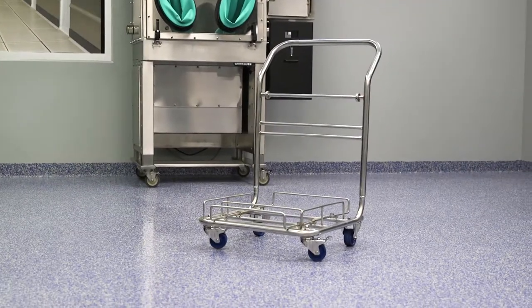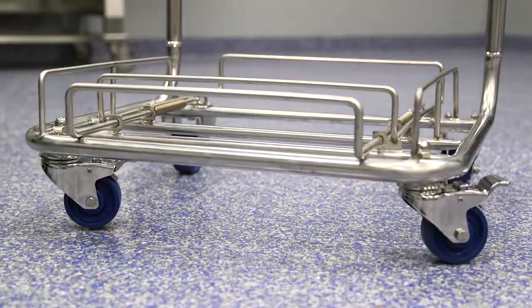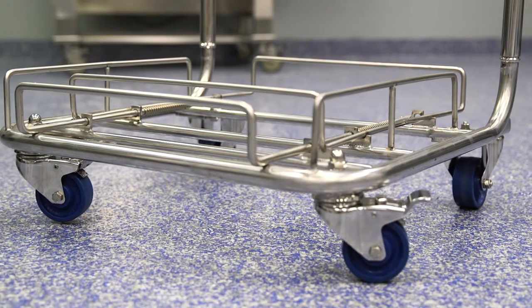This video will address proper care and maintenance of contact cleanroom trolleys and casters. We will cover removal of casters from the trolleys, disassembly, cleaning, and replacement of casters.